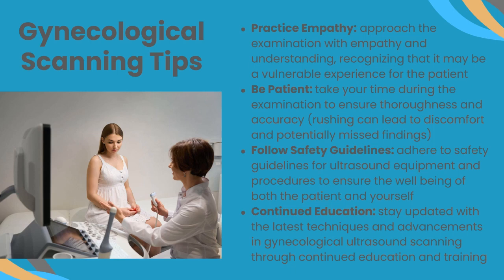Follow safety guidelines. Adhere to safety guidelines for ultrasound equipment and procedures to ensure the well-being of both the patient and yourself. And stay up to date with your continuing education and training.